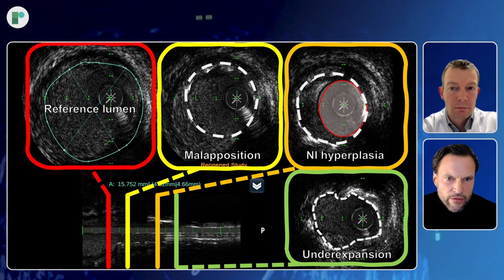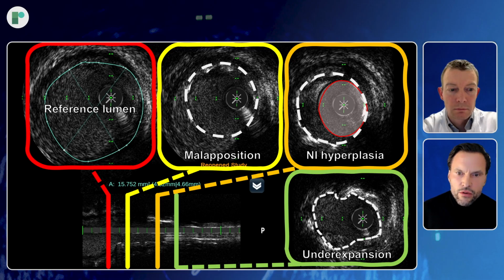And for me, every patient with de novo angina after pre-treatment and stent placement is automatically a complex situation, because you can't really estimate the total amount of disease just by doing an angiogram. And this is clearly an indication for IVUS to understand what's going on, and then to plan your treatment strategy in those patients.